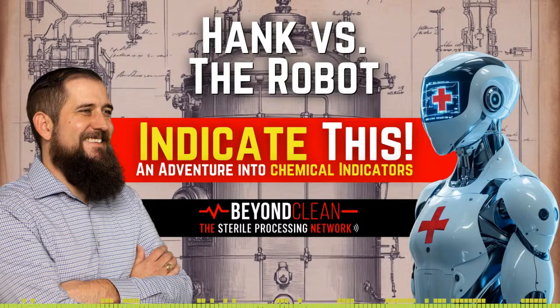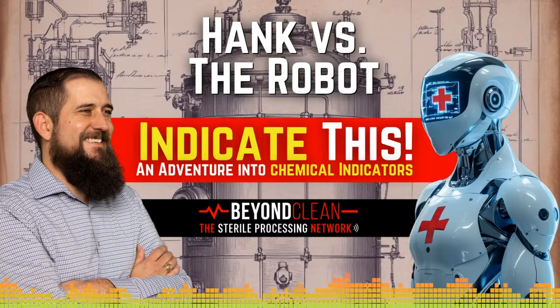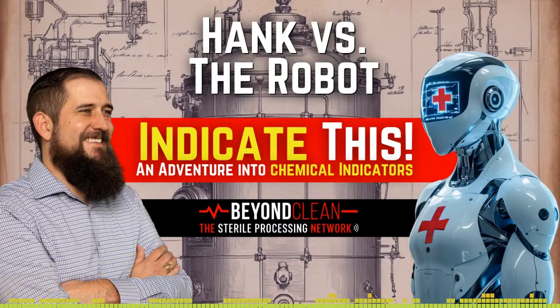Great segue, Hank. False passes in chemical indicators or integrators are one of those sneaky risks that can undermine the entire sterilization process if you're not careful. Let's walk through how these might happen and the scenarios you'd want to watch out for. Scenario 1. Improper sterilizer conditions. If the sterilizer is malfunctioning but still creates enough of one parameter, say heat, but not enough sterilant or exposure time, a chemical indicator might change color even though the full sterilization cycle wasn't achieved. Indicators, especially basic ones, are prone to these kinds of false positives because they often measure a single parameter without integrating the bigger picture.